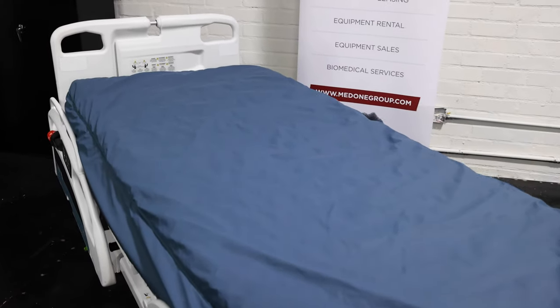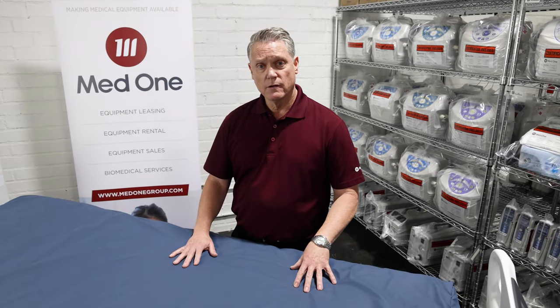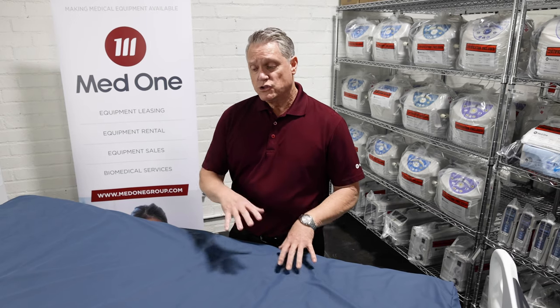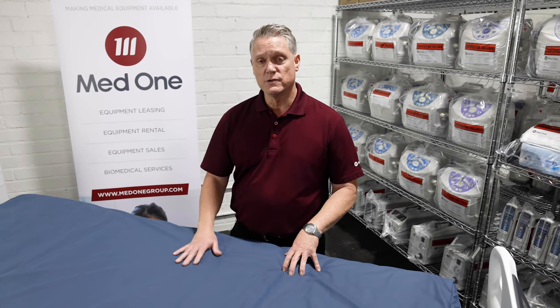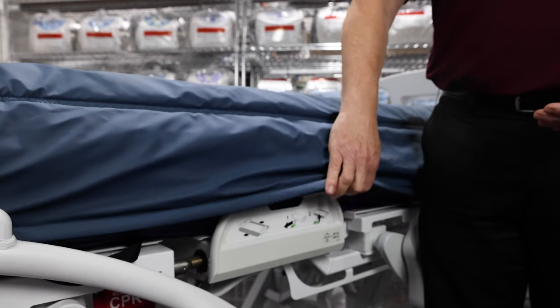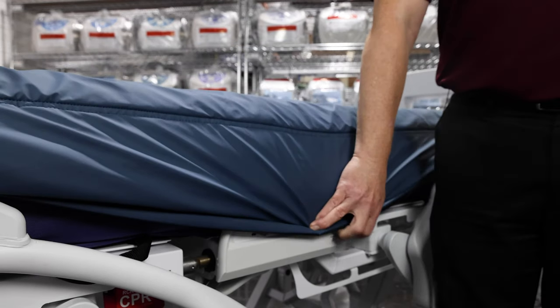The mattress cover on the Blue Chip PowerPro Elite is a stretchable cover, which will allow greater immersion into the mattress. It is a low friction, low shear cover so that it won't pull at the patient's skin. Should this become soiled, you can use your standard hospital wipes to wipe down the mattress. Also on this mattress there is a 360 degree zipper which will allow us to replace the cover as needed. The cover also includes a rain guard for the zipper, keeping liquid from penetrating inside the mattress to keep your mattress clean.